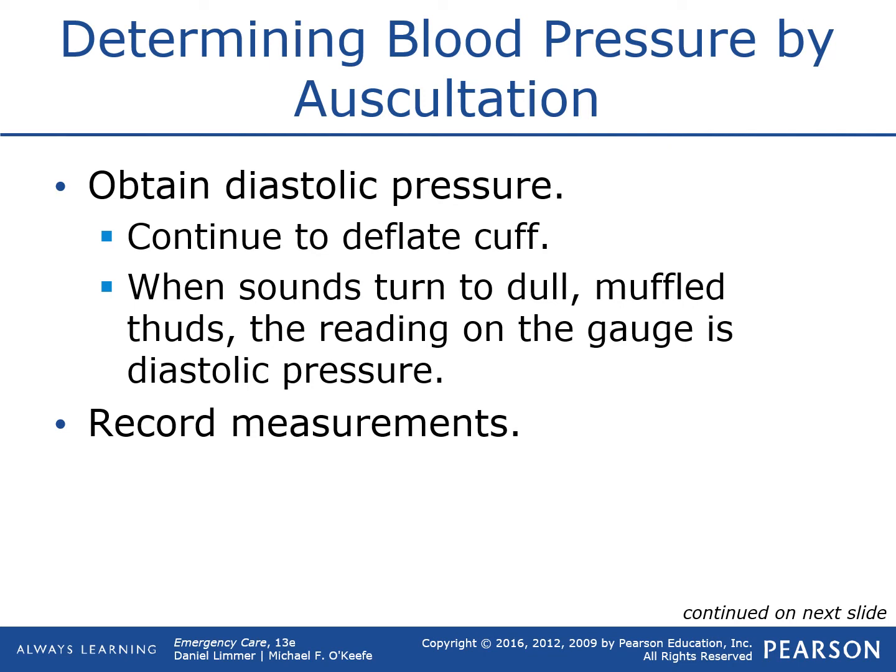That means that the amount of pressure that you're putting on the artery is less than the amount of pressure that is constantly in that artery. So there's no occlusion happening, so you don't hear the heart coming against any pressure anymore. So that is your diastolic blood pressure. So you want to know your systolic and your diastolic, when you start hearing the heartbeat and when you stop hearing it.